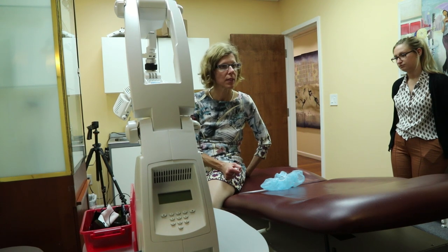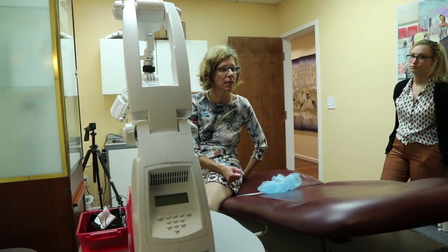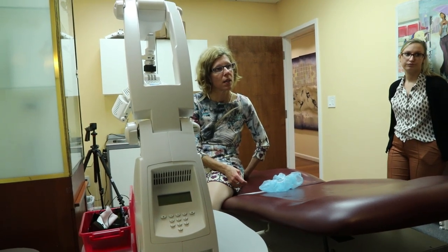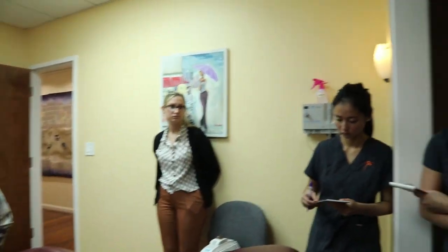We need to do a little role play for how to instruct patients when they're first coming to photodynamic therapy. After acetone degreasing, the patient might have already been instructed that they need either CO2 laser perforation, microdermabrasion, or 1540 nanometer laser treatment — that is already scheduled with the estheticians. You're going to be escorting the patient to that room. Sometimes it can be curettage. Then you bring the aminolevulinic acid with you and apply it basically in that room before going to the dimmed room.